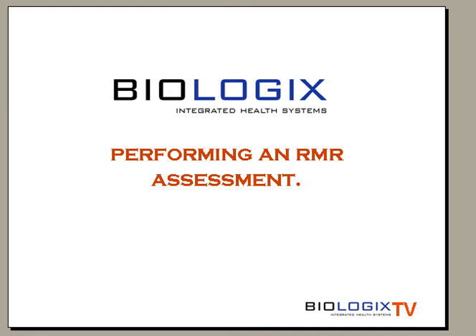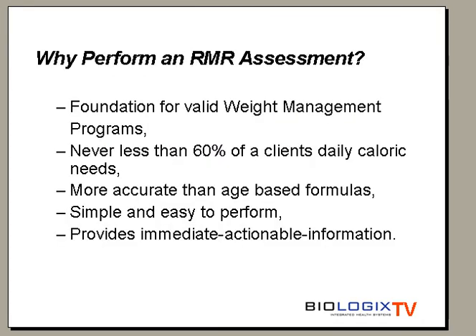My name is Gary McCoy and I'll be your host for this session, performing a resting metabolic rate assessment. So why perform an RMR assessment? Well, RMR assessments are the foundation for valid weight management programs.